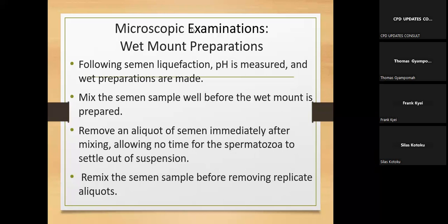Since you are dealing with 22 by 22 millimeters, you are dealing in millimeters, and therefore the microliter should also be converted to millimeters. Once you convert the microliter, you get 10 millimeter cube. You know that for a volume, it is length times breadth times height.